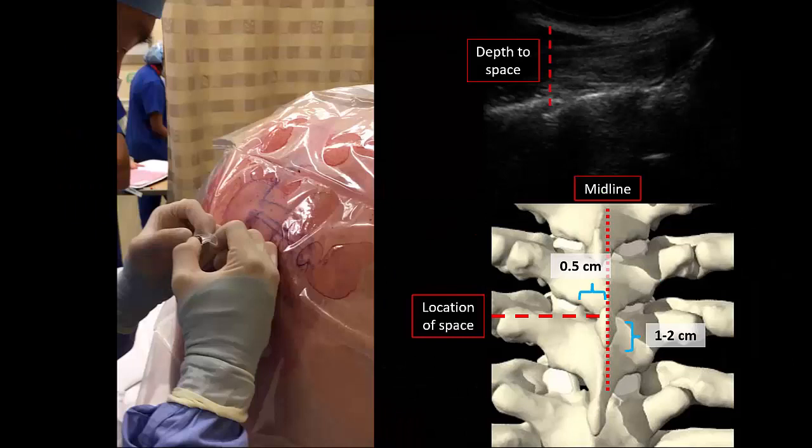Here is a video illustrating the needle insertion process after scanning and marking. The vertical line on the patient's back is the midline, and the horizontal line is the location of the interlaminar space. The needle, as said before, is inserted 0.5 centimeter lateral to the midline and about 1.5 centimeters inferior to the interlaminar space.